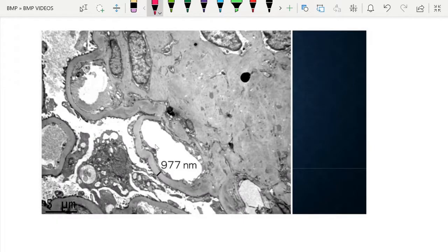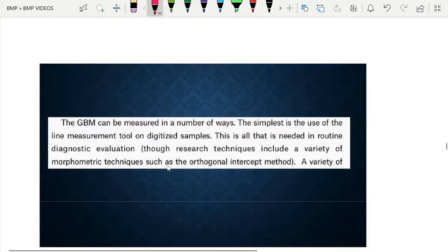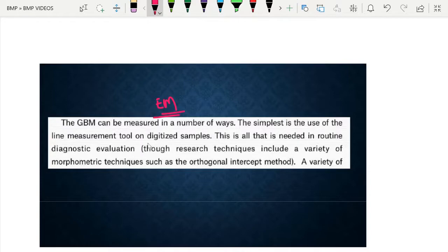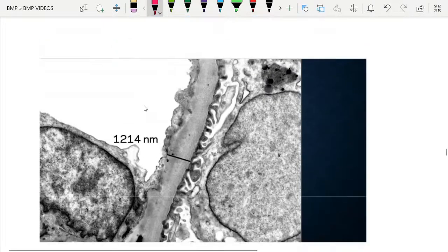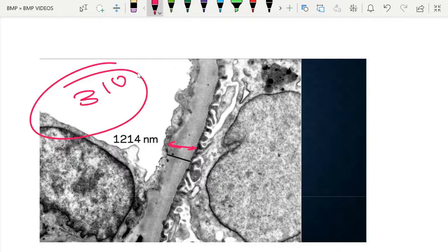Another electron microscopy image demonstrates GBM thickening in diabetic kidney disease. GBM thickness is measured by a digitalized electron microscopy method where the biopsy sample is analyzed by software, though the method may vary from lab to lab. The normal GBM is 310 nm, and here it is approximately four times thickened.